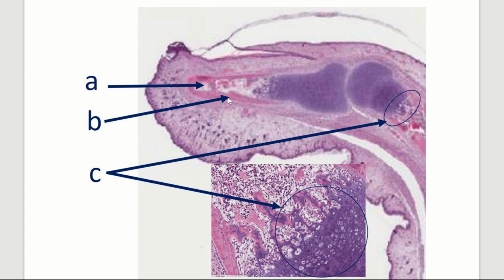Okay, so what these two are depicting, right? A is pointing into kind of the middle of the bone. So this is part that has already been turned into bone. And it's depicting the middle of that. So that's going to be where we have our spongy bone. And remember, in a fetus, this is where we do have a lot of bone marrow activity. So that's why it's not as dense as normal, but this is our spongy bone.